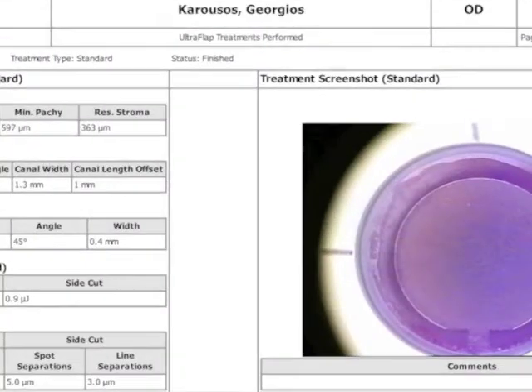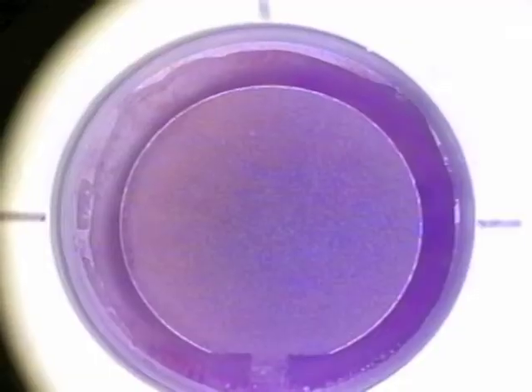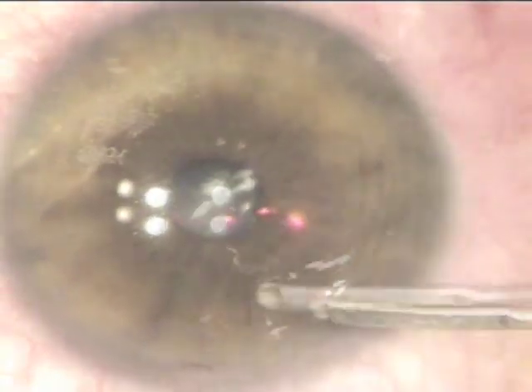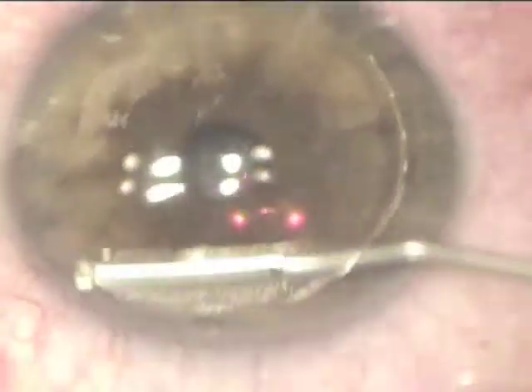Please note, compared to the pupil, how the ablation looks decentered to the left, which is nasal. And you can also see here on the report from the FS200 the actual femtoflap. And now I'm showing you here the pupillary aperture and how the flap is decentered nasally to match our topography-guided treatment. Single-use irrigation spatula. I just use one instrument in the LASIK procedure.